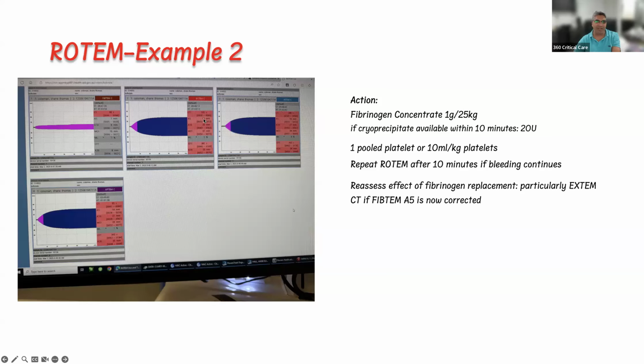Because the increase is around 10, it's not too high. But again, this is just a rough estimate. It's very hard to see how much platelets are contributing to this abnormality as long as you have to correct the fibrinogen first. But again, we sometimes look at the difference. The difference is not too high. That means there is a contribution from platelets also.